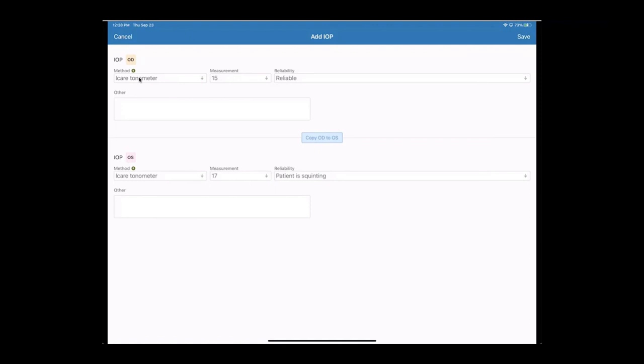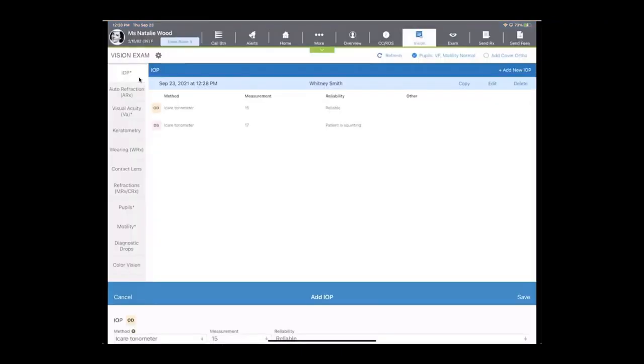Now if you have the ability to connect your auto-refractor, your keratometer, your NCT, you'd like to connect those electronically, we can typically connect to them, and you can send this data over electronically as well.